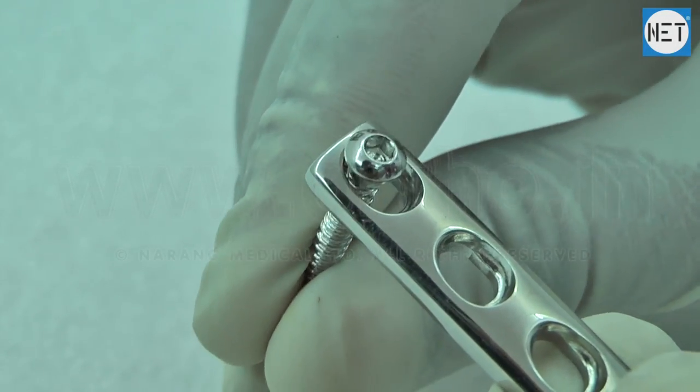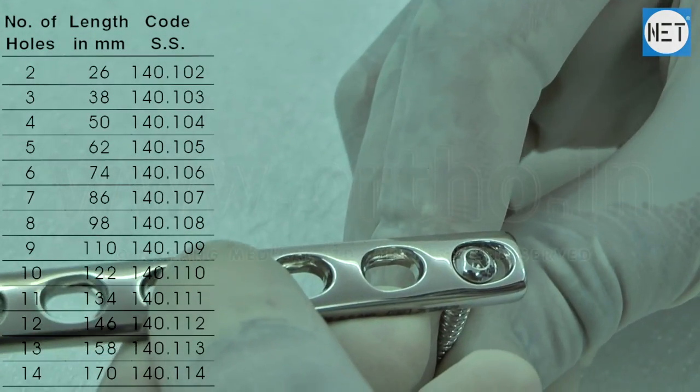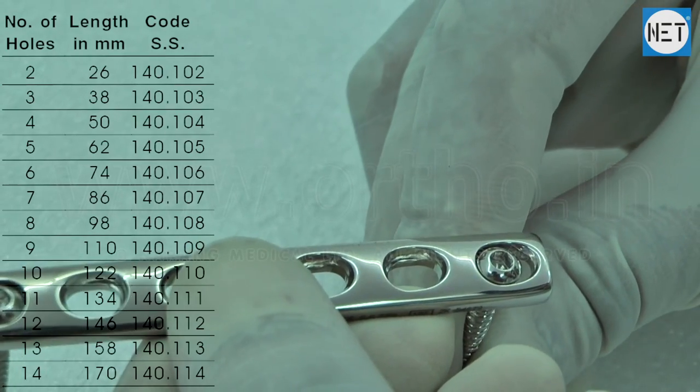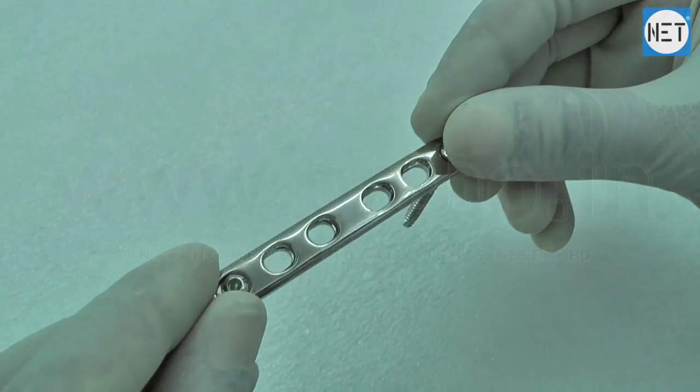These plates are available with number of holes varying from 2 to 14 and in lengths varying from 26 to 170 mm. Dynamic compression plates are available in stainless steel and titanium.